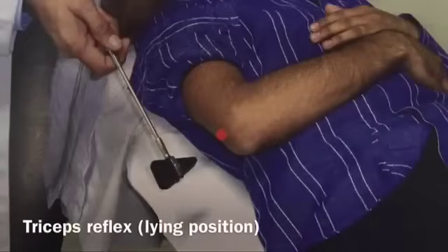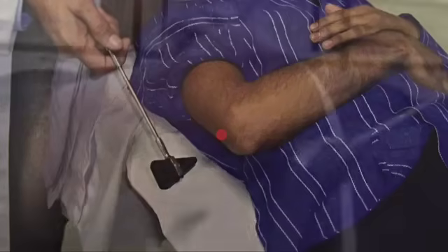Tricep reflex — lying position. Ask the subject to lie supine, flex the elbow, and allow the forearm to rest across the subject's chest. Tap the triceps tendon just above the olecranon with the narrow end of the patellar hammer. The triceps contraction leads to extension at the elbow.